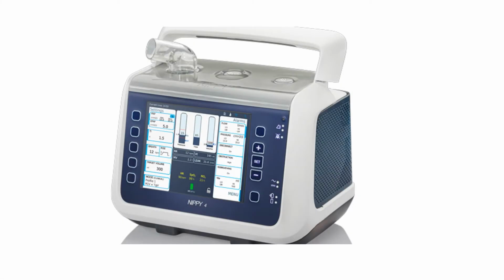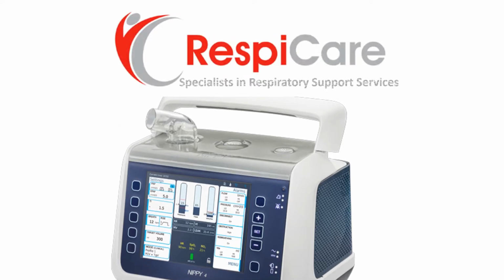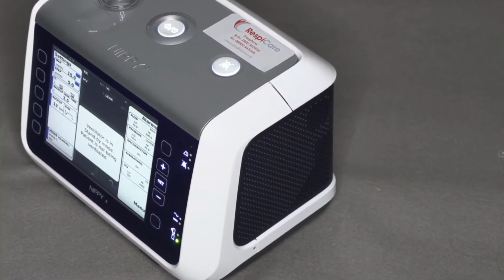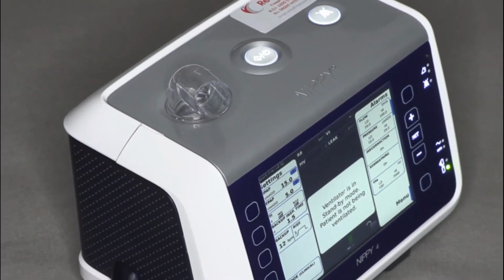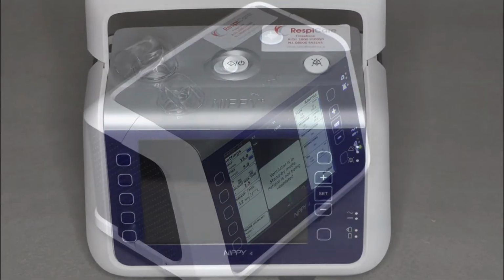Nippy 4 is a pressure-controlled positive pressure ventilator manufactured by Breas Medical and supplied and supported in Ireland and Northern Ireland by Respicare. Nippy 4 takes ambient air through a filter at the side of the device and delivers that air through the outlet at the top, using this air to deliver the therapy that has been set by the prescriber.